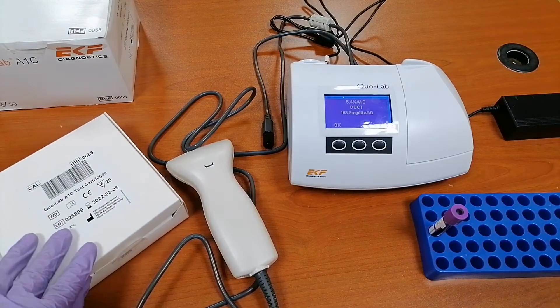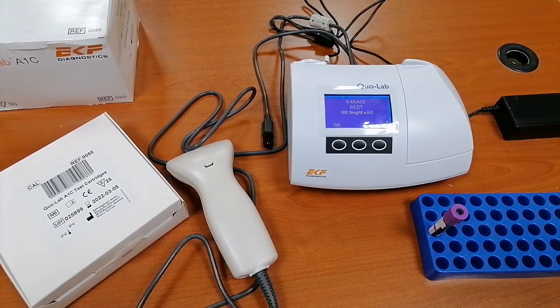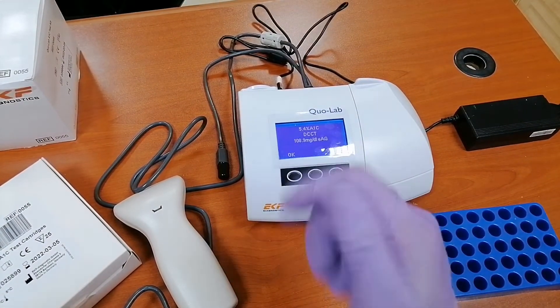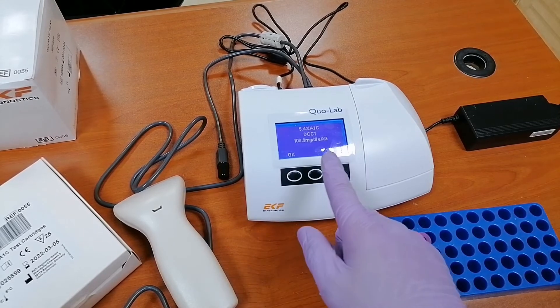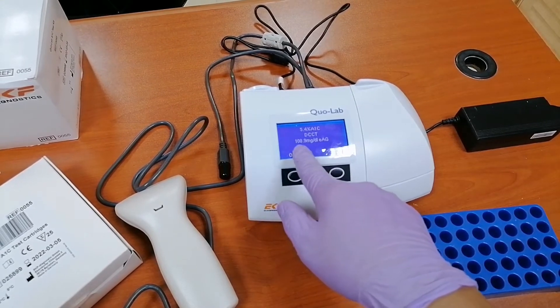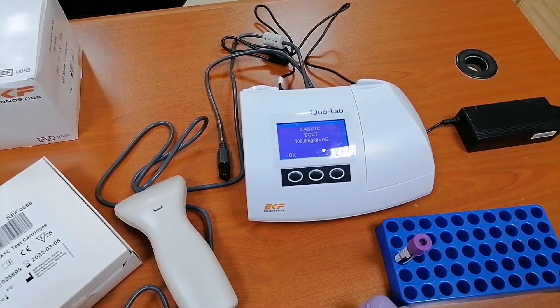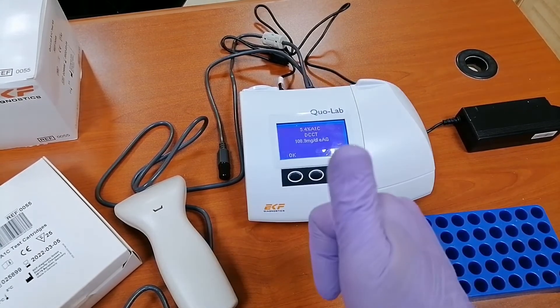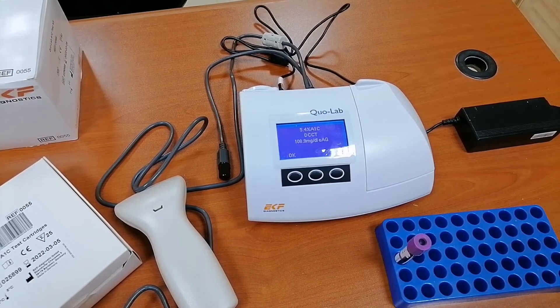My HbA1c as you can see is 5.4, and in mg/dL it is 108.9 — so 5.4 DCCT. HbA1c is normal. That's how the HbA1c process works in this machine.